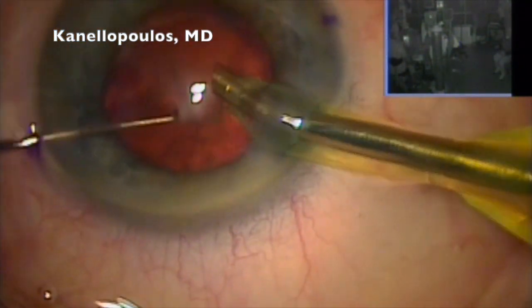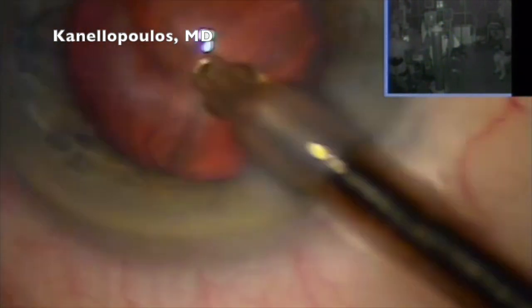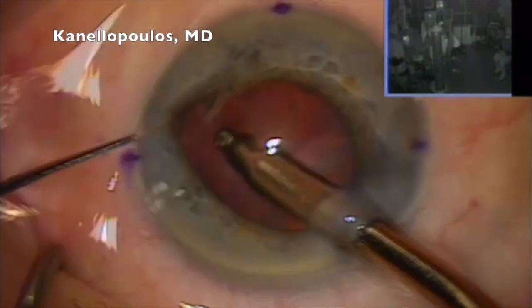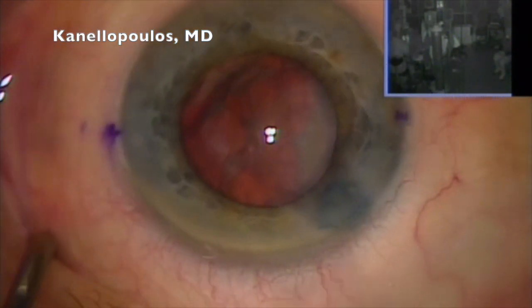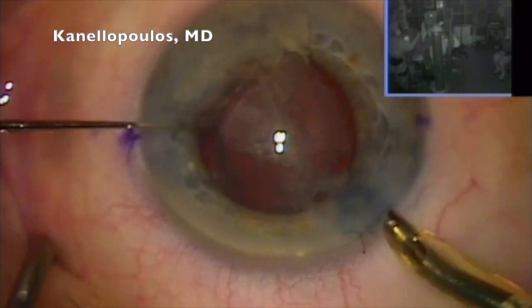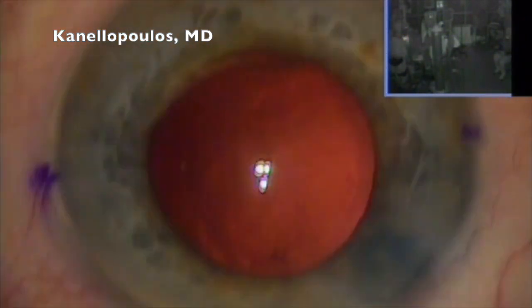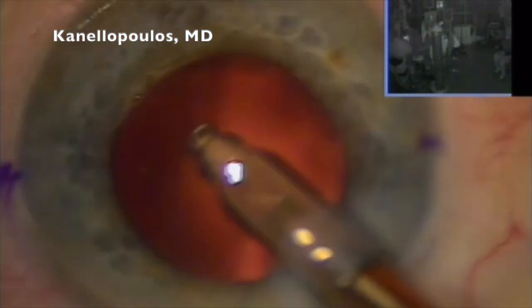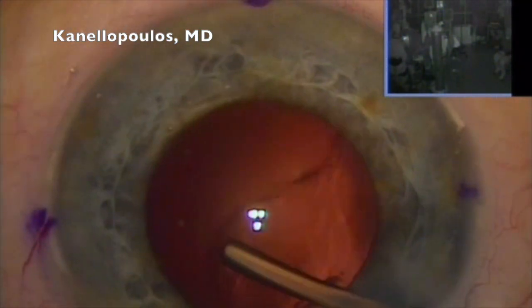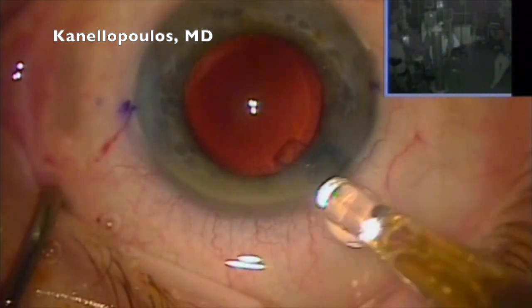So even if I'm at 200 joules total energy here, a big cortical shell left behind, I'm going to try and tease it out here with fluid and go in again with my phaco tip and save time, remove it en bloc. Essentially no cortex left. In lieu of putting the capsule in danger, this patient also had pseudoexfoliation. I'm able to fulfill the dream, use a toric lens here.